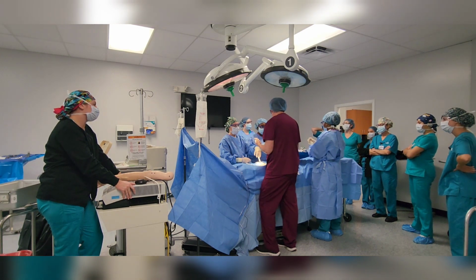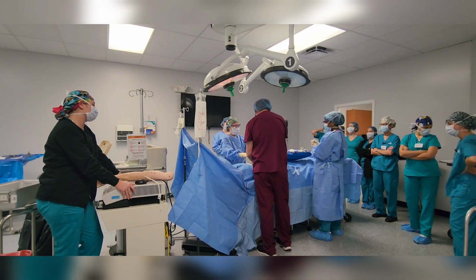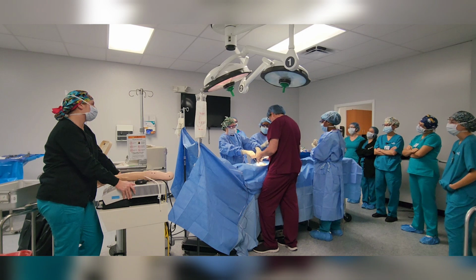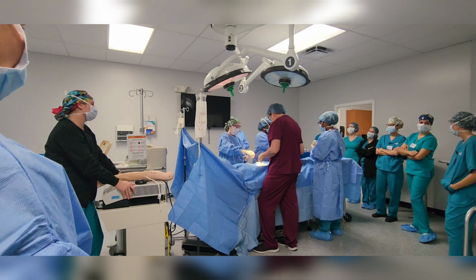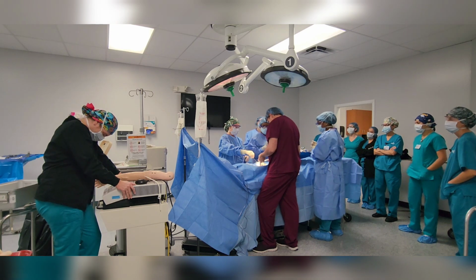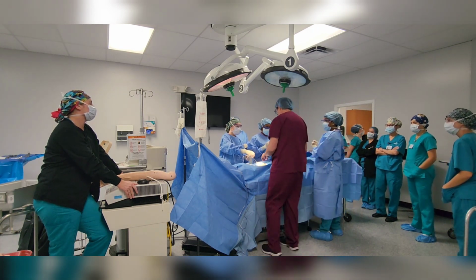Anal retentive, but that's just the way it is, right? Hold your hand out. Right, good. Babcock. All right, good. Take that out. Can I have a scissors? Straight mayo. Good. Clip that one. Can I get a medicine bowl? All right, good. What time is it? Suture? We have no suture.